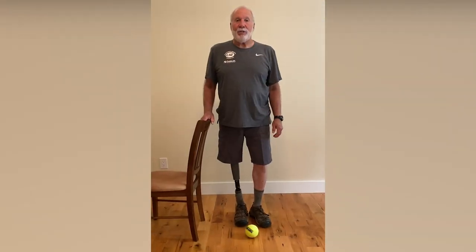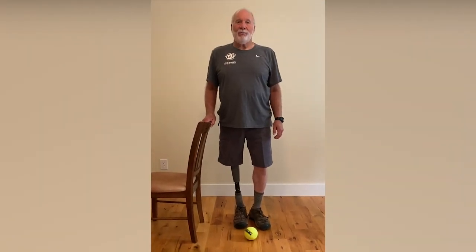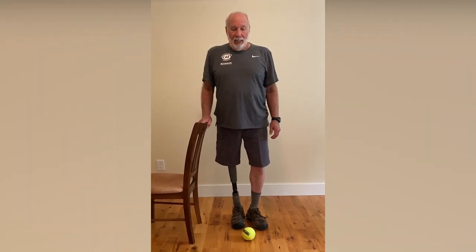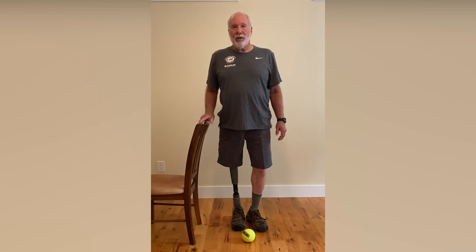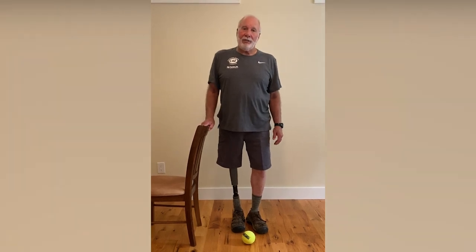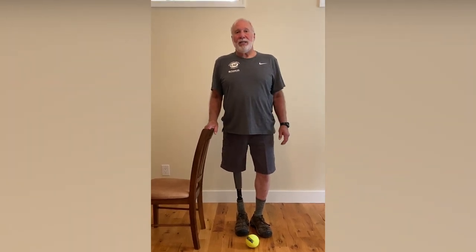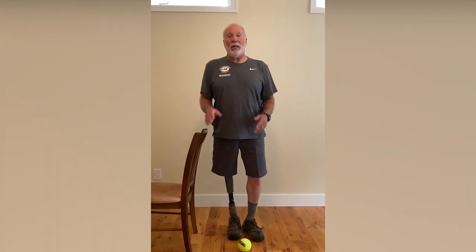So now I'm going to demonstrate a little exercise that will help you with your balance, especially balancing on your prosthetic limb. What you need to do this is a chair or something to kind of stabilize yourself, because it's pretty hard to stand on your prosthetic side without help. And you need a ball, and it can be a tennis ball. This is a little bigger than a tennis ball, or even a little bit bigger ball.